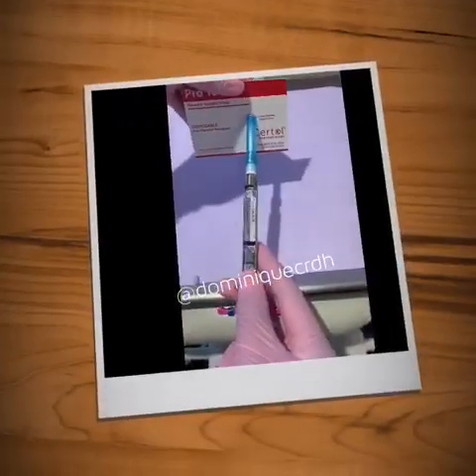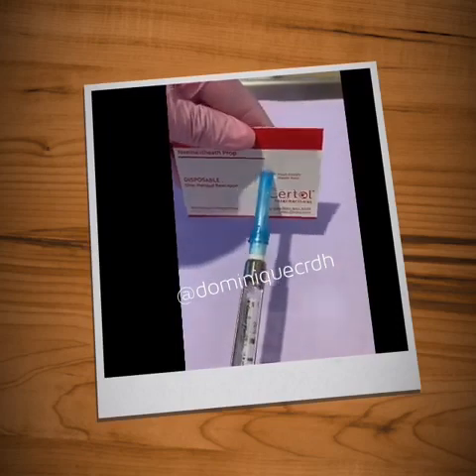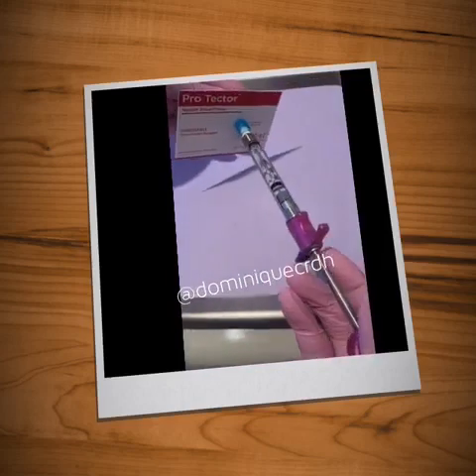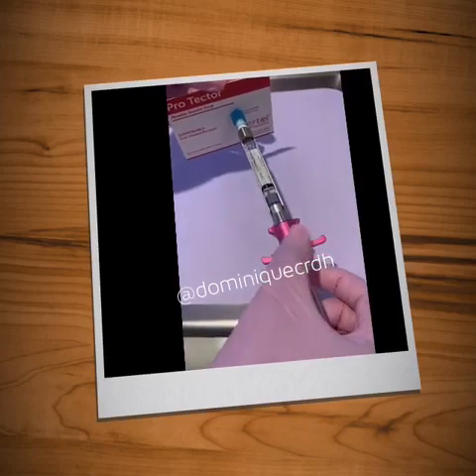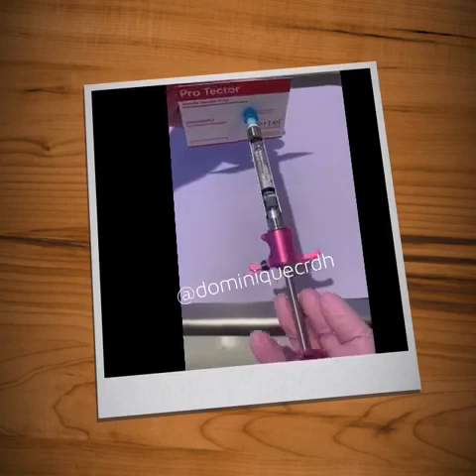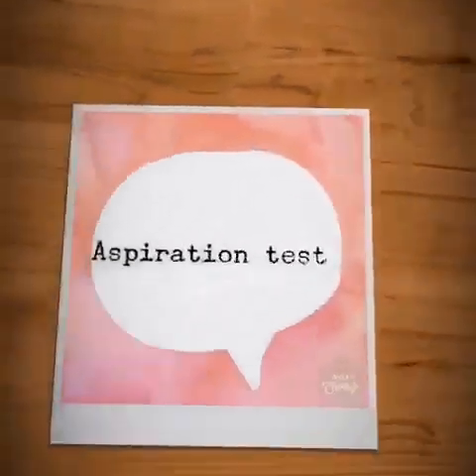Attaching the syringe to the protector shield is accomplished by just taking the tip of the cap of the needle and pushing it right through that hole. This is a really important step in protecting yourself from needle sticks as you are removing the cap of the needle from the syringe. It also helps to protect yourself when you are dismantling the syringe and disposing of the needle.